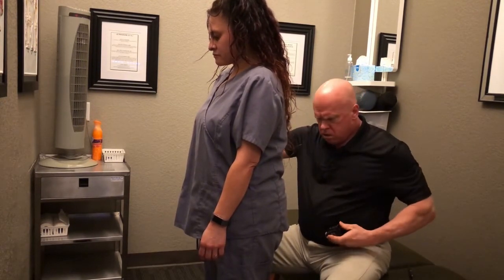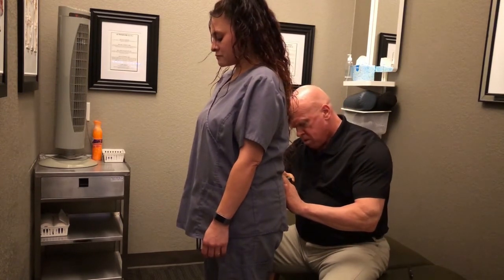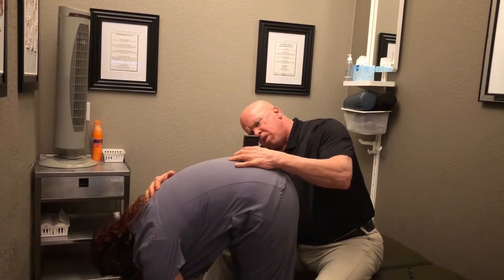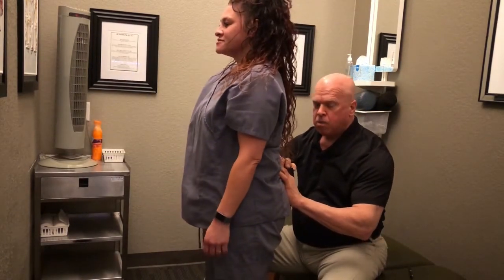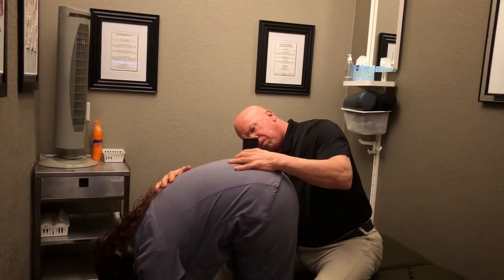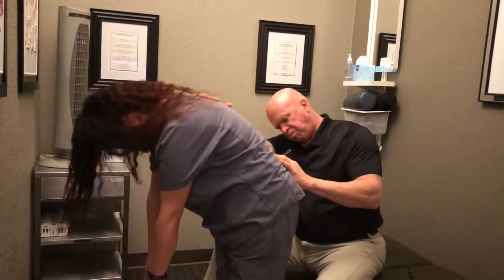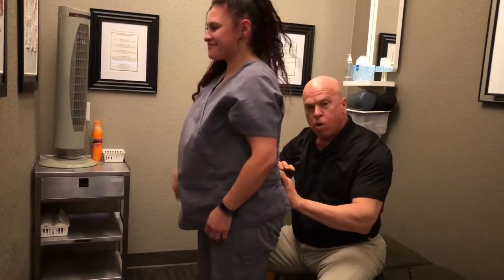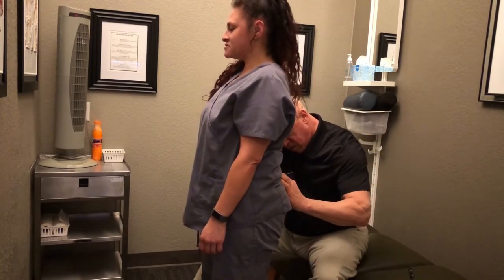Take your single digital inclinometer, zero the instrument, place it over the S1 spinous process. Again, zero the instrument. Okay, and I'll have you bend forward, reach for your toes, go as far as you can. And record your measurement, which in this case is 74 degrees. And up you go, zero the instrument, repeat 2 times for a total of 3 measurements. And up you go, that's 76. So we got a 74, a 76, and last one. And 74. Okay? And those are all within 10% of each other, so that indicates a valid effort on sacral flexion testing. And now sacral extension, go ahead and lean back as far as you can.